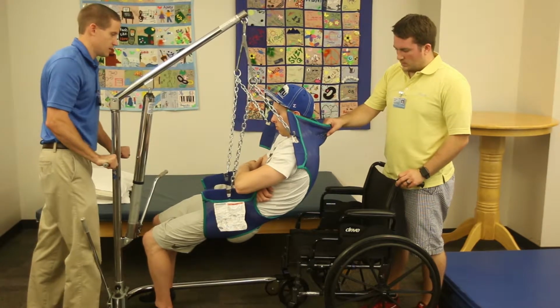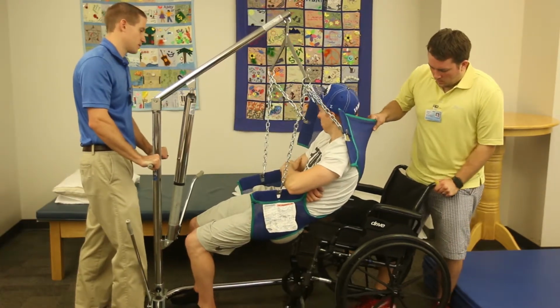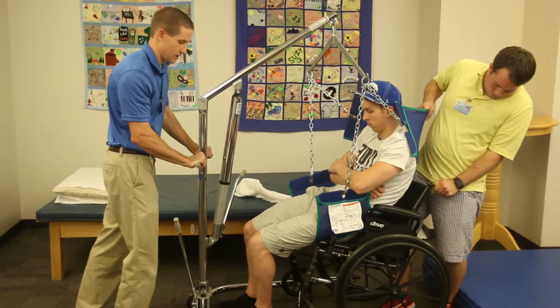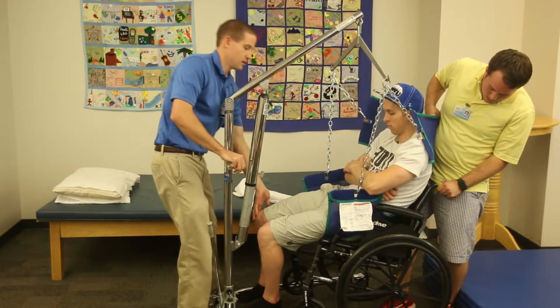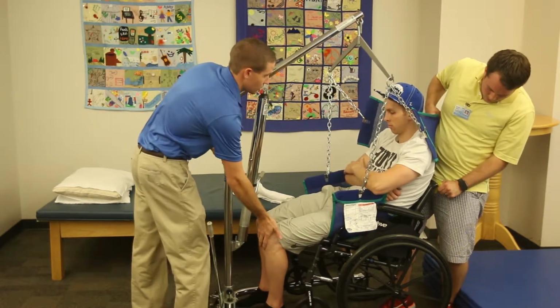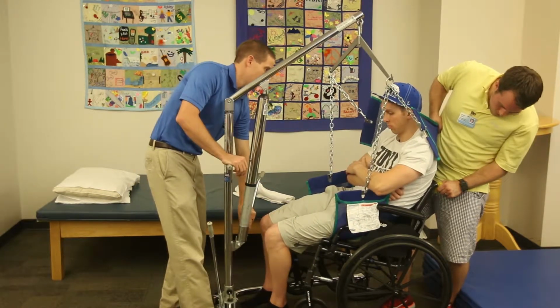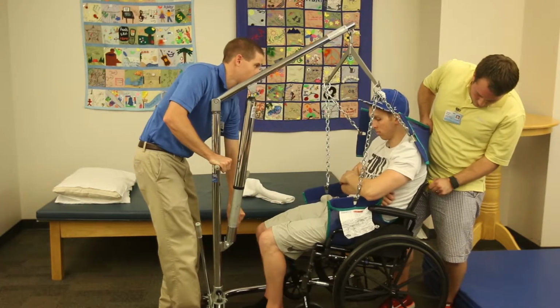Okay, so let's bring you in. Now lean that back, yeah, perfect. And now let me know on his back. Yeah, his back's touching the back. Okay, so what we're gonna do, as I start lowering him down, just make sure that bottom's right there for him. Okay. And then let the chair go down with him.